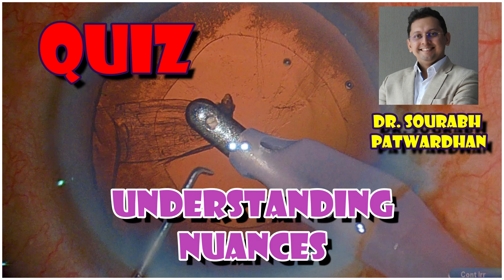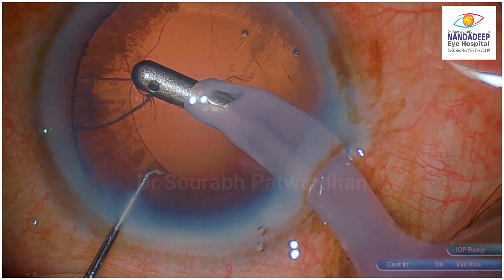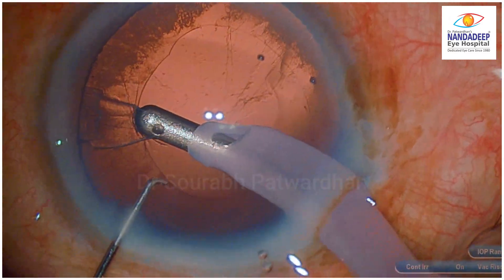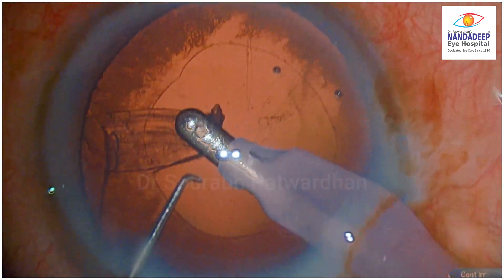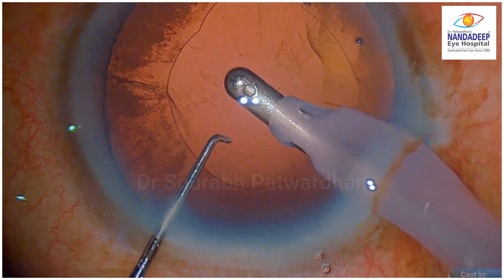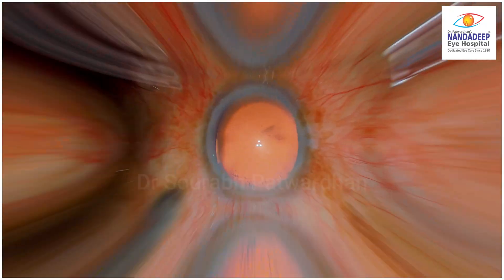Now this was an eventful surgery in the sense that the patient had a good outcome. But watch what I observe at the end of the surgery. You can see that when I was removing this cortex, there was some subtle zonular weakness which was noticed. Also, there was some posterior capsular bulge.